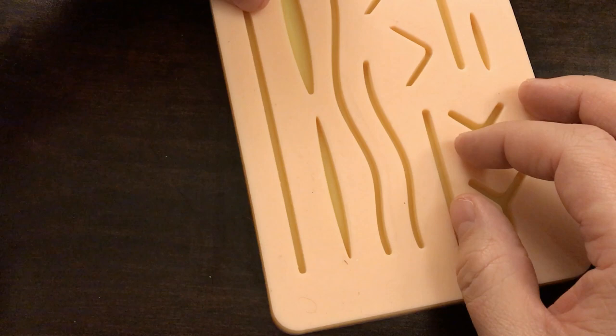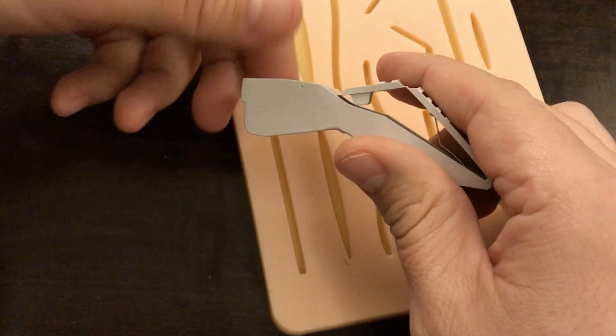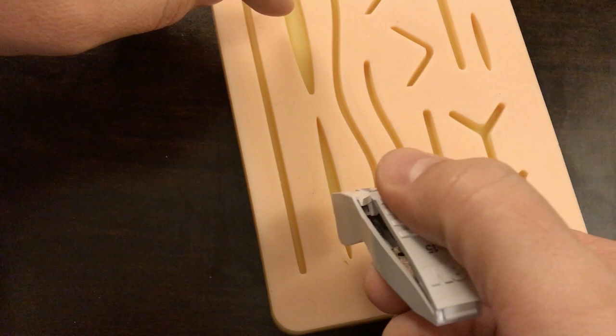Before I actually perform this, I want to show you there are different types of staplers. This one here is one of the smaller, cheaper versions that are pretty common to find in urgent cares and emergency rooms. It's a bit smaller — just a small handheld device, and you push down here in order to have the staples come out the end. This one does require that you're angled a bit, and I'll demonstrate that in a moment.